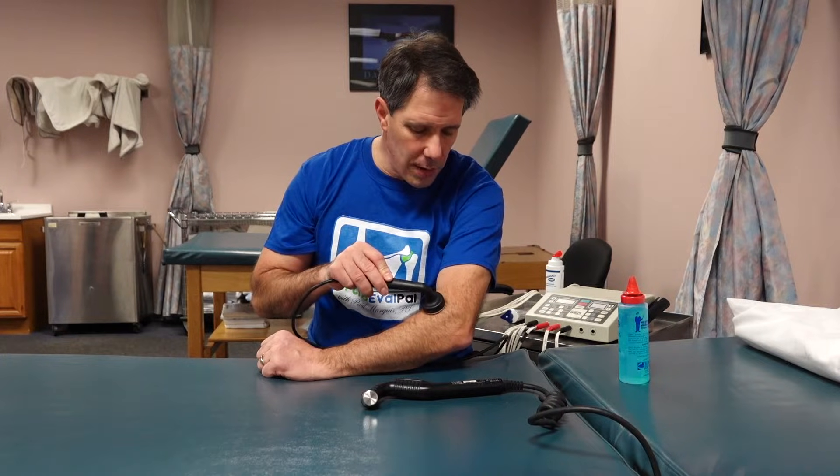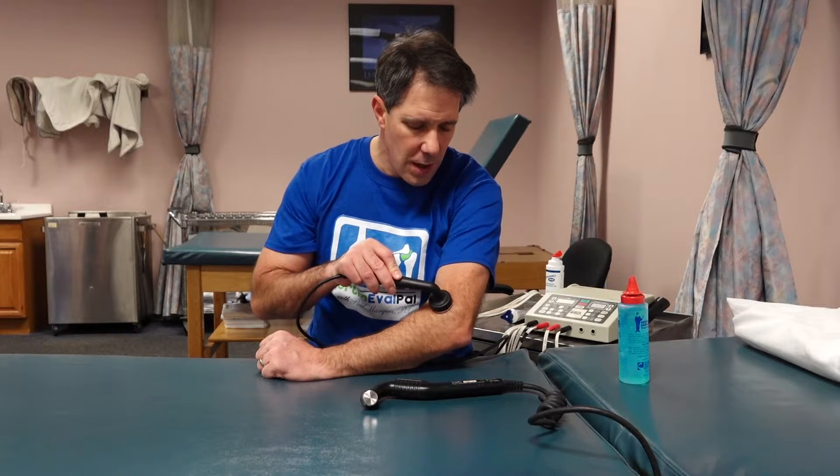There are continuous and pulsed ultrasound modes. If somebody comes in with an acute injury with a lot of inflammation and swelling, you probably want to use pulsed ultrasound. I typically use 50% pulsed for subacute or acute presentations to help decrease inflammation. When using pulsed ultrasound, go a little slower so you get that pulsating effect — 50% means you're getting 50% sound, then it stops, then sound again. Continuous means the sound wave is on all the time, which is more thermal. You don't want to do continuous on someone with acute inflammation or a fresh ankle sprain.